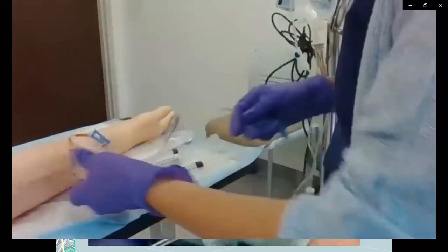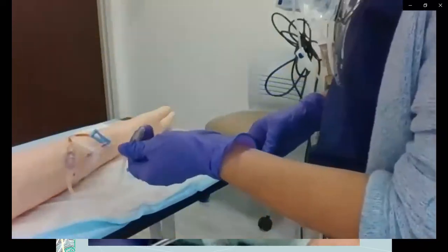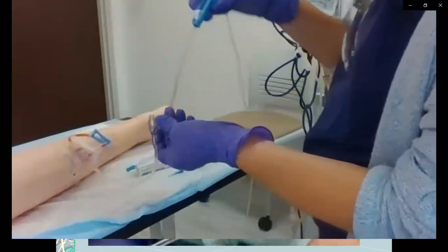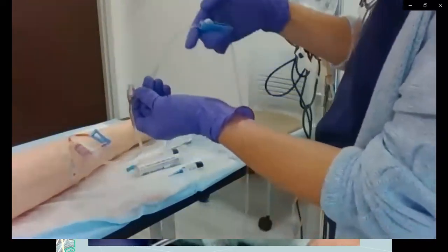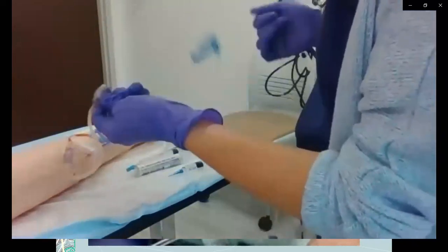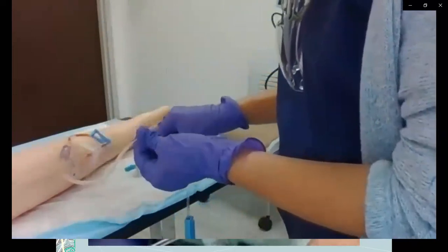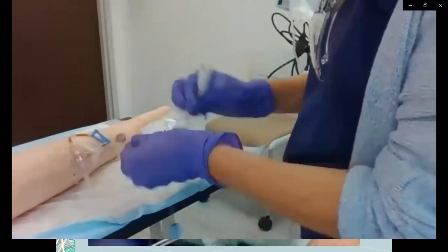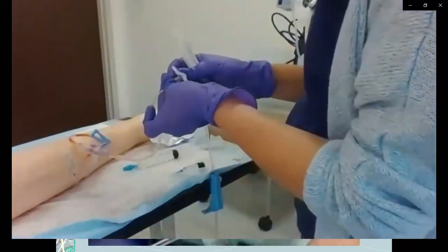So we're gonna go through this closest port to the patient. So we've selected that port that's closest to the patient. Close off this IV line. We're gonna pause it if it's on a pump and close it because we don't want what we're giving in here to back flush up. So first things first, we're going to clean our site.